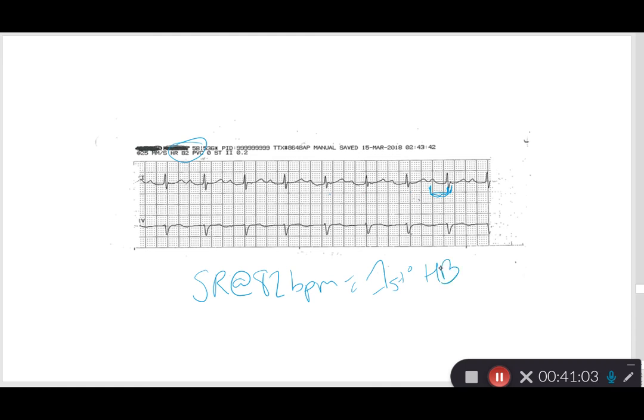And these are definitely your most lesser of the evil of heart blocks. So a lot of patients don't even know that they have a first degree heart block, or a lot of patients are taking medications like a metoprolol or beta blocker that causes these heart blocks. So a lot of times this might be normal for the patient. It's not something that we correct.